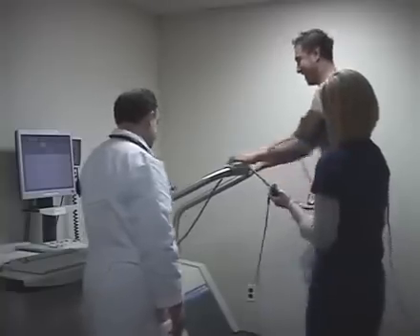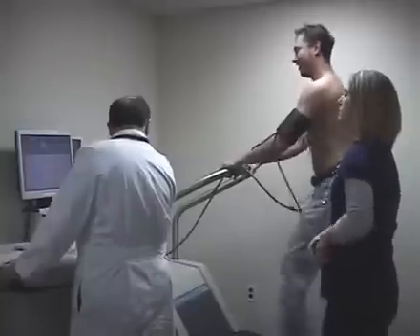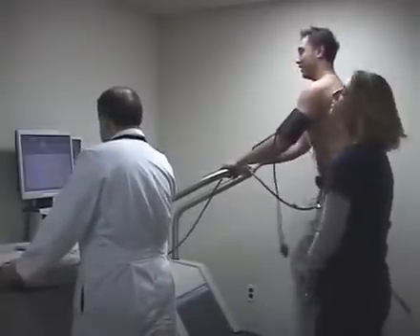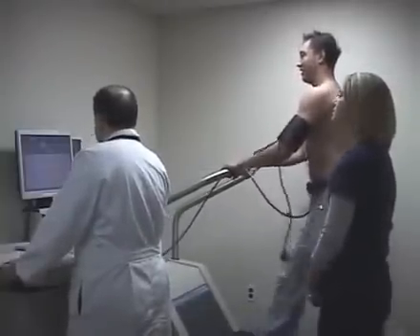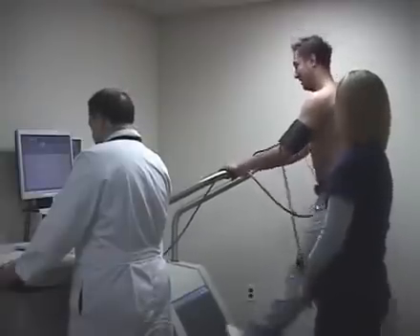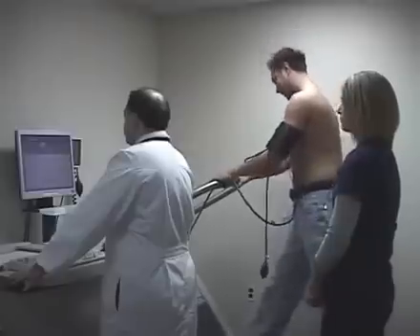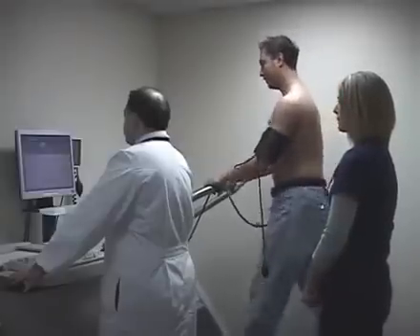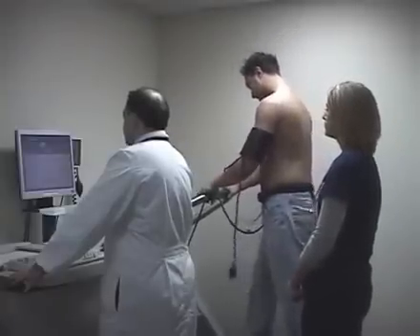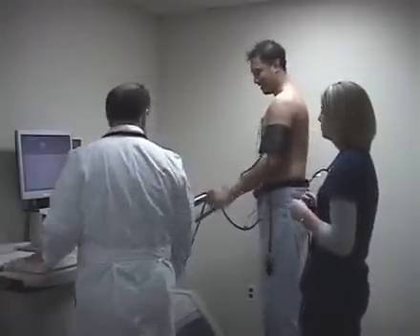During the treadmill stress test, we also monitor oxygenation. We just placed the pulse oximeter on the finger to look at oxygenation and make sure the patient is getting enough oxygen throughout the body. As you can see the patient is going faster — we've now reached the target heart rate and we're stopping the treadmill stress test and asking him to come lay down on the bed so we can look at the ultrasound of his heart.